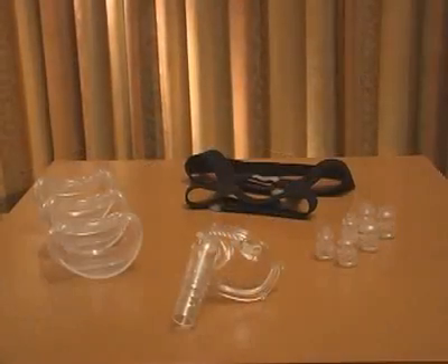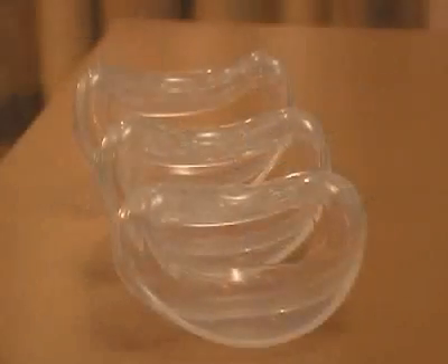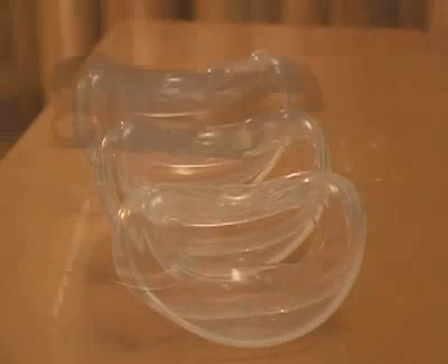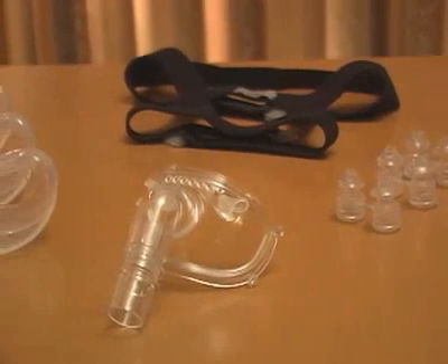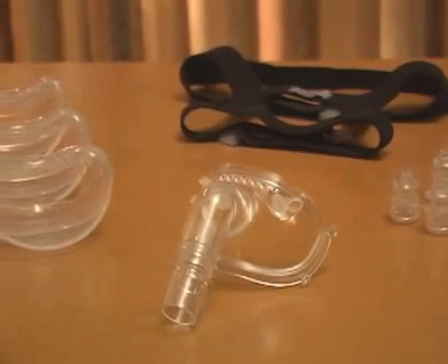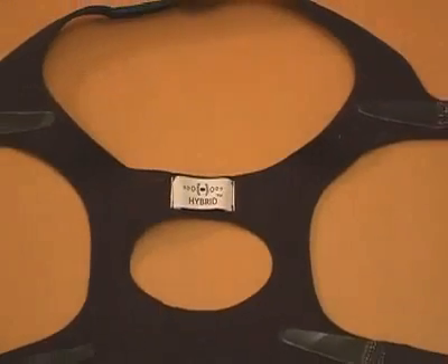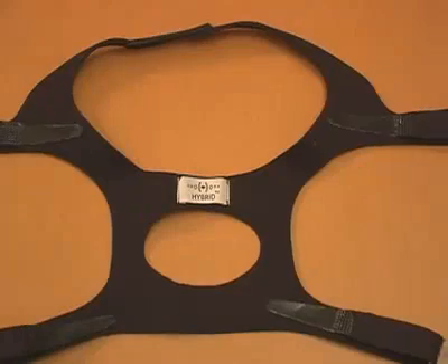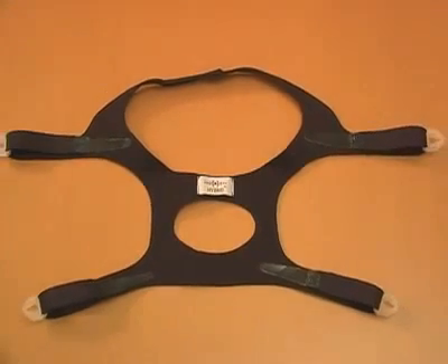The hybrid universal interface is packaged with three sizes of nasal pillows and three sizes of oral cushions. All pillow sizes fit all cushion sizes. This configuration is designed to give the clinician a minimum of nine sizing options for an optimum fit. Also included with the hybrid is a premium headgear that has five points of adjustability to provide ultimate stability of the interface.